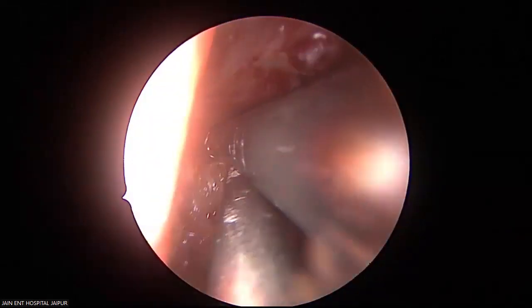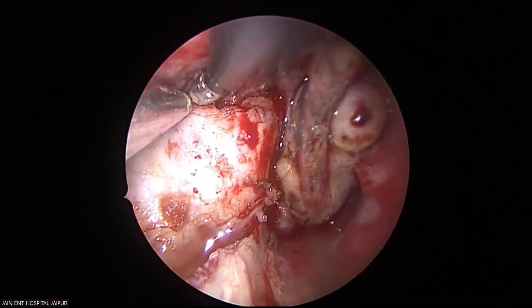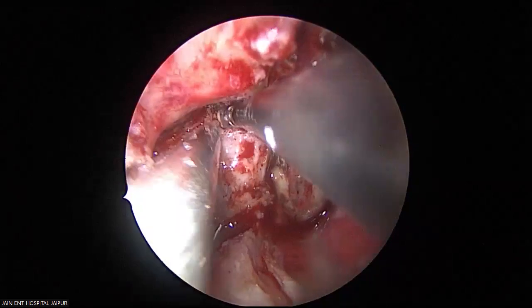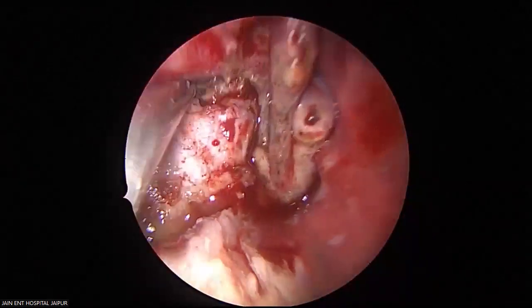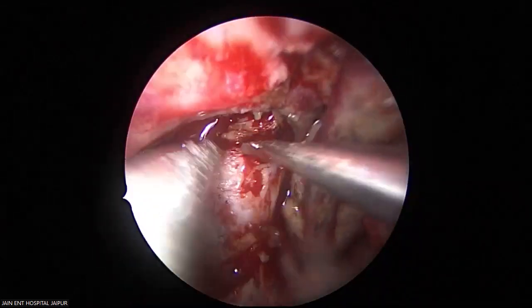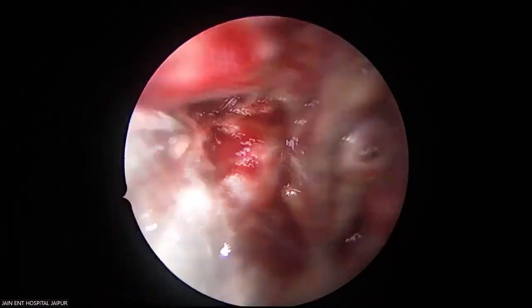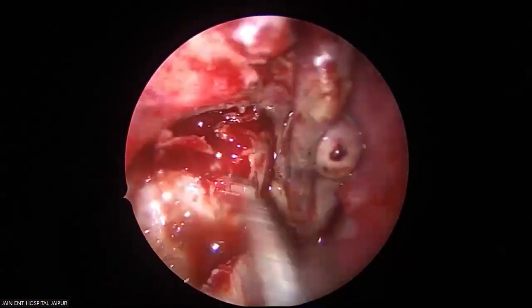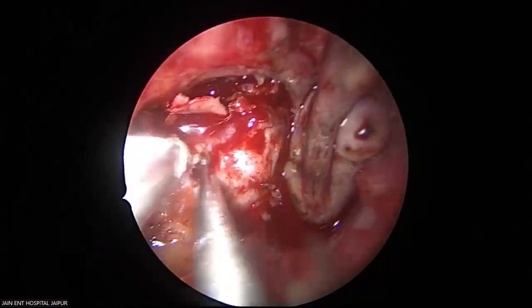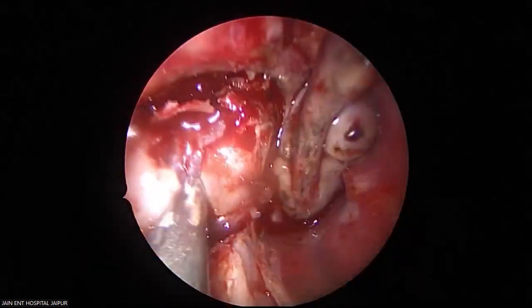See, bone is dehiscent at places, as the tumor is bulging from behind, making this wall more and more prominent and distant. Now we have to remove this. See this thin bone, you can fleck off. If not thin, you have to drill off or you can punch out, whatever. What I'm exposing is the pterygopalatine mucoperiosteum.